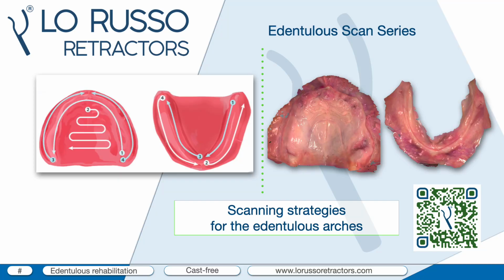Welcome to the Advanced Edentulous Scan series. This curriculum is designed for clinicians aiming to master the complexities of full-arch direct digitization. In this session, we will dissect the scanning strategies required to achieve a high-performance clinical experience and a reliable digital representation of the edentulous arch.